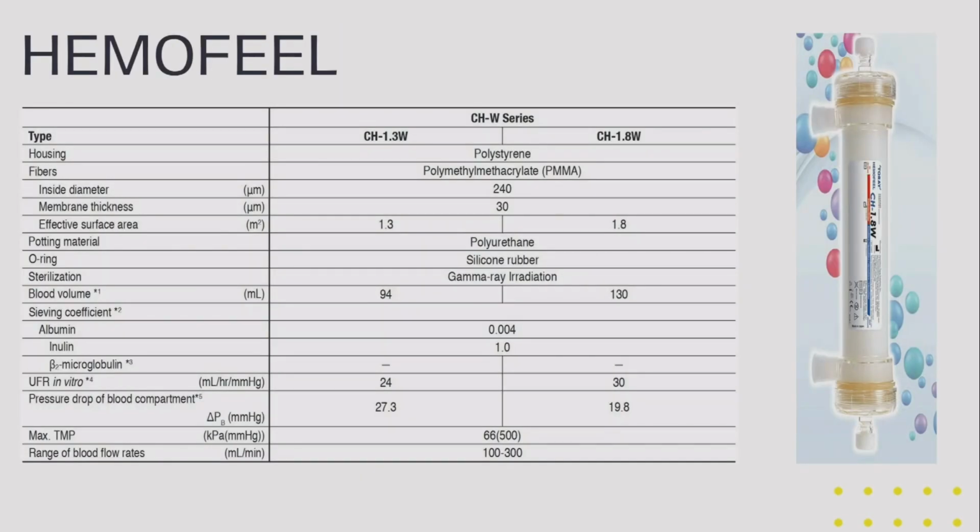Second is hemoperfusion. Up till now, what we saw, there is no dialysate. Just a cartridge. We run the blood through it and give it back to the patient.